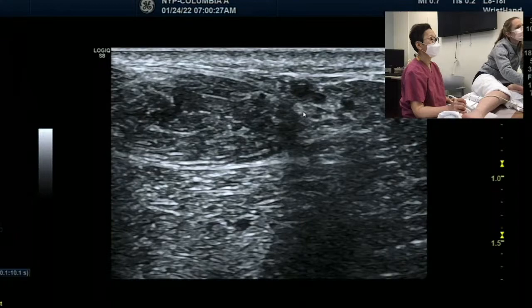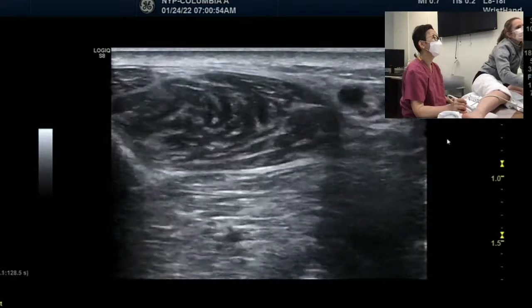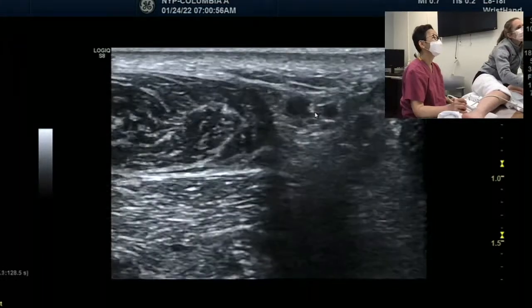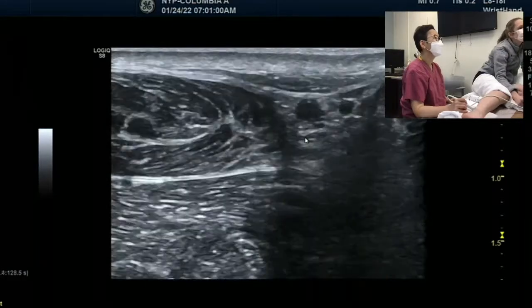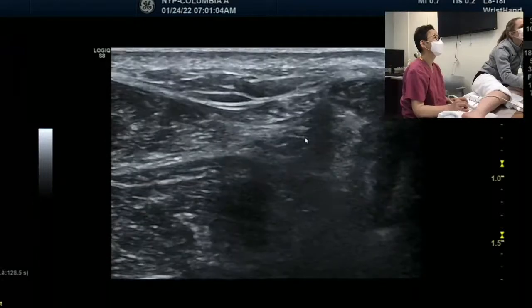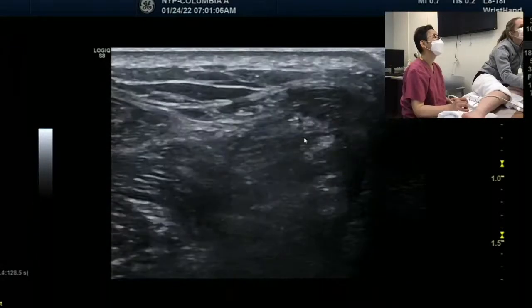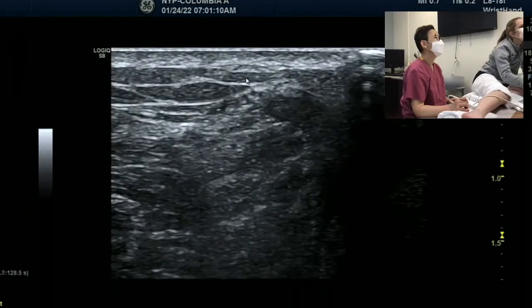So we're gonna double check, unfreeze. So we still see that one right over there? See it right there, underneath that one. See, it's moving. It's gonna come to the superficial adipose tissue area. It's now going into adipose, see? Right here.